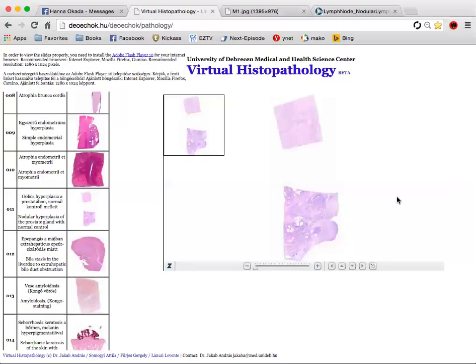Prostate carcinoma would begin at the periphery of the prostate, while this benign hyperplasia begins in the center. And this is very common in men. Over the age of 70, maybe 80% of men will have this, even more.